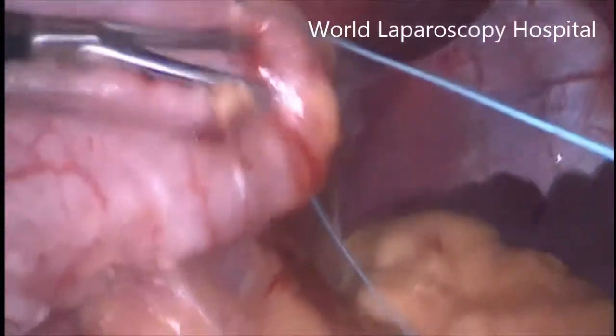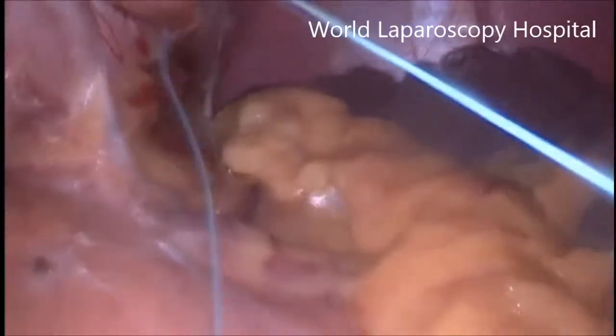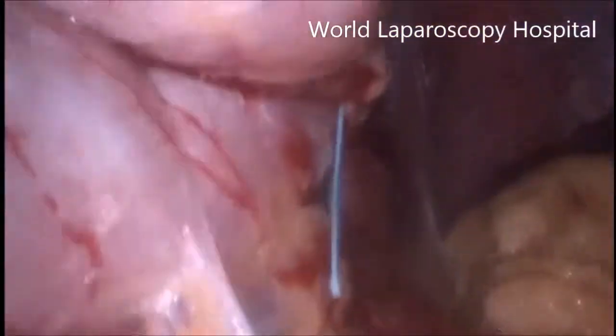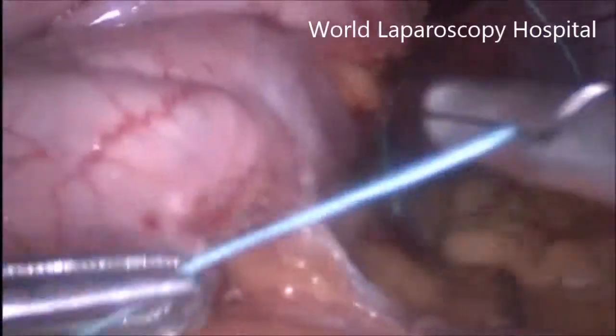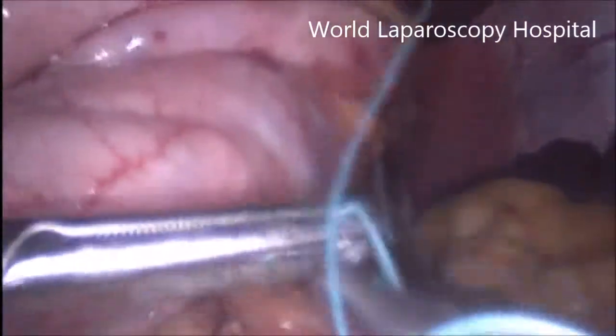Slowly suturing has to be started. Laparoscopic suturing and knotting should be very good in cases of this surgery. But the patient is rewarded in that he will not have to bear the cost of the stapler.